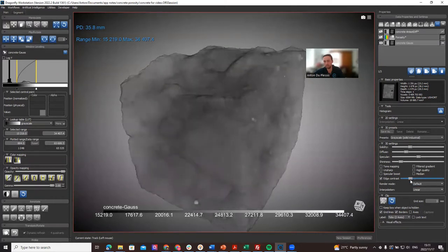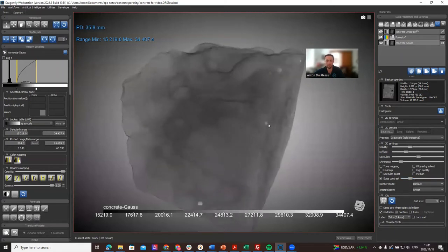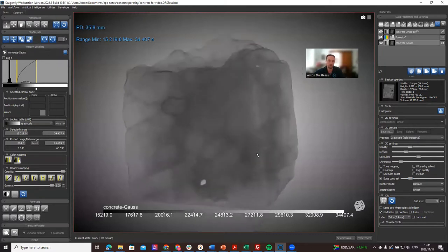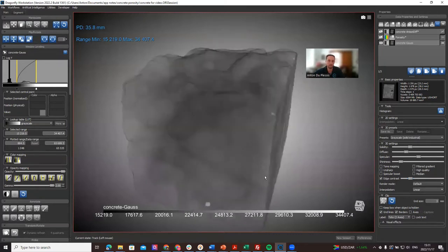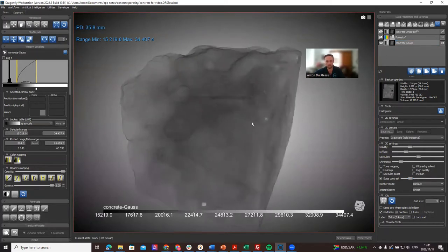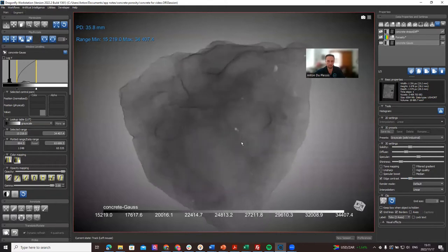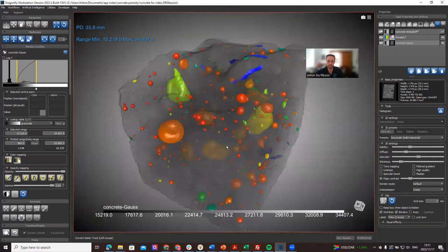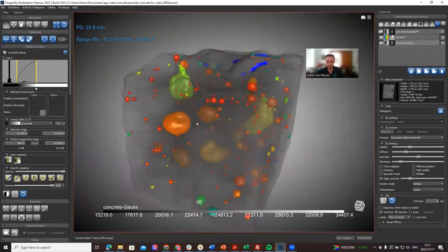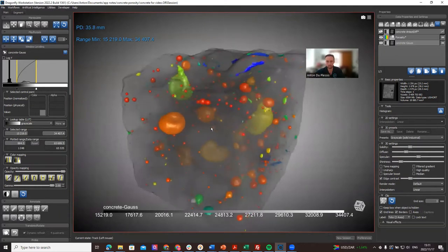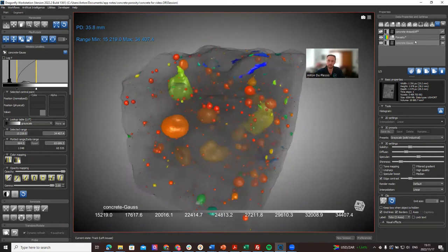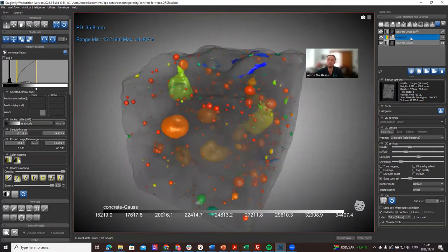it provides a transparency method of creating transparency while still seeing edges of the object on the opposite side and internal features which have edges. This is quite nice for making a good visualization of internal structures, especially when you have internal structures visualized with this edge contrast transparency slider active. Here we have some pores, the porosity which is being visualized with this transparency slider, and because we have the image channel activated, the pore information for color coding legend is not shown.